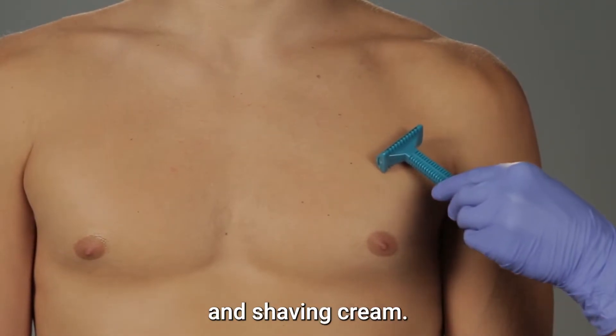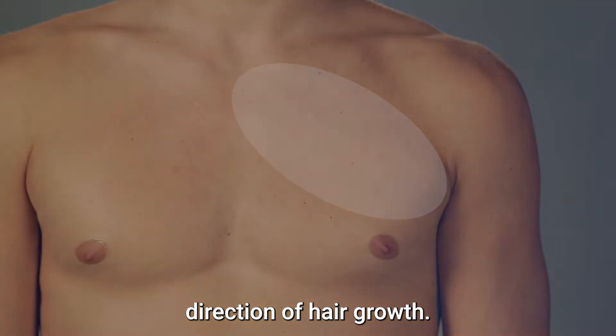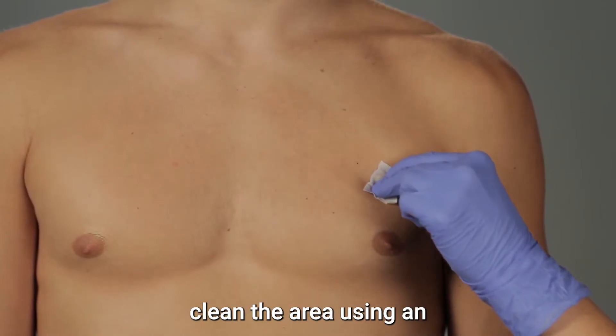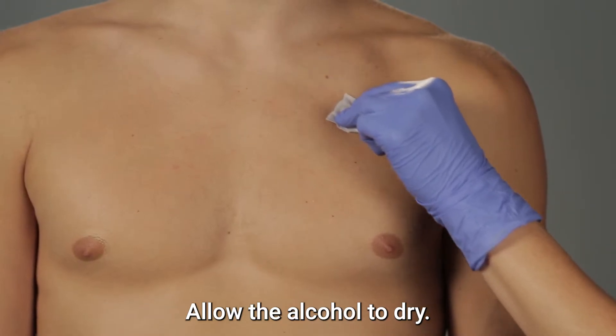To shave, apply warm water and shaving cream. Shave the area in the direction of hair growth. Rinse the shaved area with warm water and then dry. Whether you have shaved or not, clean the area using an alcohol wipe from the kit. Allow the alcohol to dry.